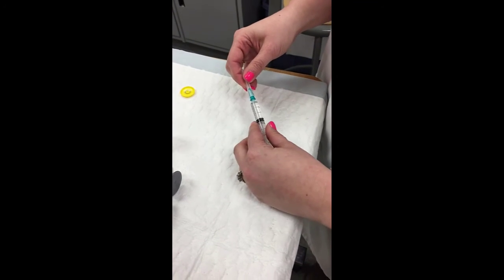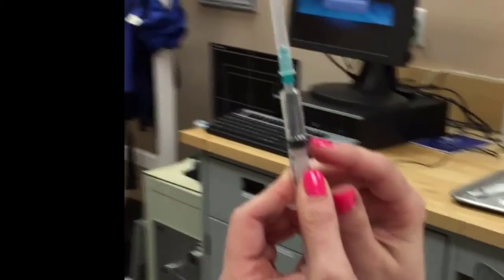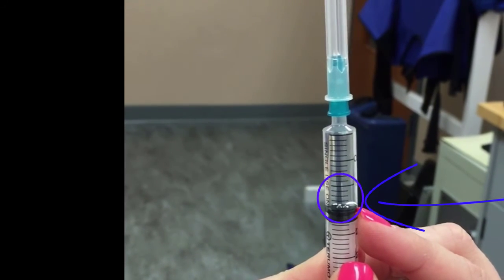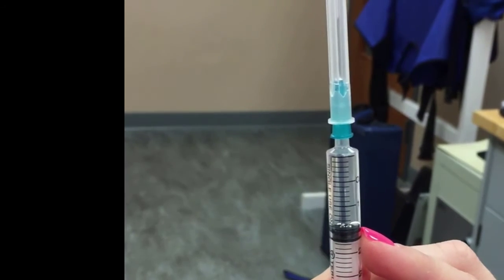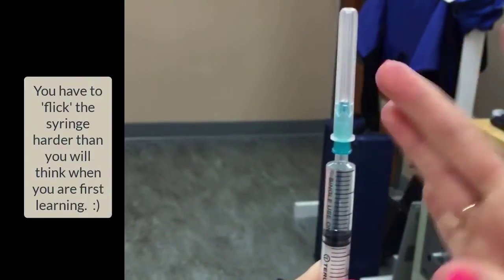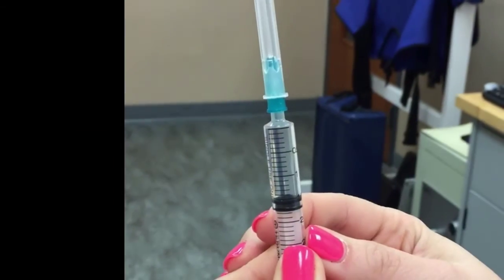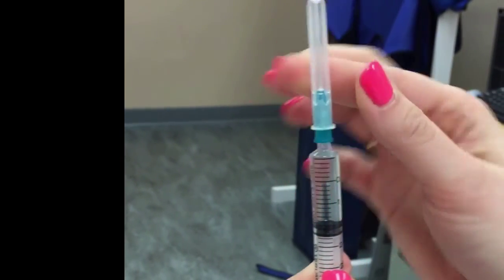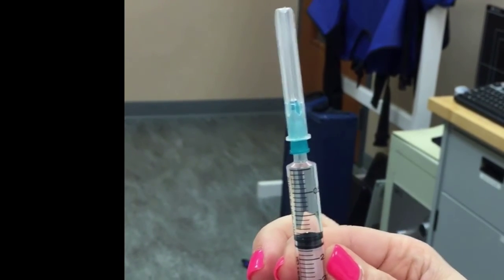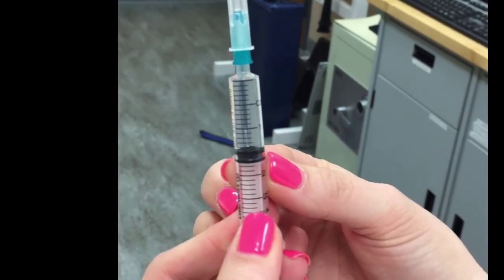Now that I have that on there, I am going to reassess my syringe, and I can see that I have a couple of little bubbles, and we do not want to have air in our syringe. We do not want to cause an air embolus in our patient. So I'm going to flick the syringe and make sure that the bubbles are removed. And I don't know if you noticed when I did that, the needle became a little bit loose. It started to wiggle, so I just made sure that I attached that and that it's secure. And now I can see that I have 1.5 mils.